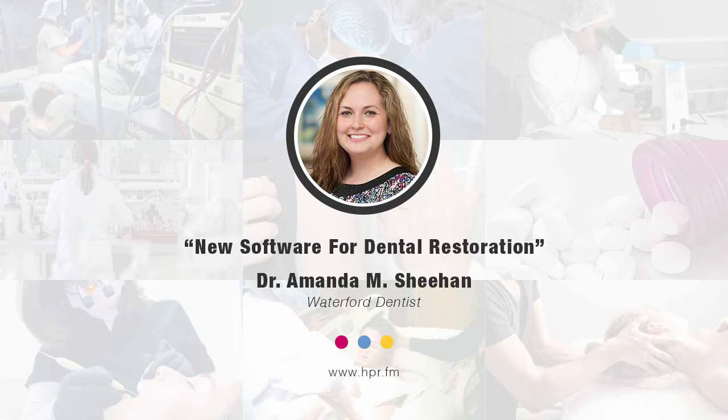Every patient that comes into the office, we do what's called a dental health scan. We take a three-dimensional record of their mouth. So in the past, people took putties if they needed some work. Now everybody, when you get your x-rays, you also get a three-dimensional scan, which becomes part of their permanent record of where their teeth are positioned, where their gums are, the shapes of their teeth. God forbid something happened to them and they got into an accident and destroyed their smile. We would be able to pull back exactly what their smile was and replicate it like nothing ever happened.